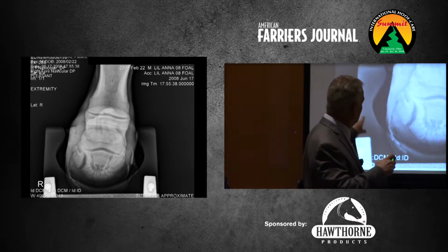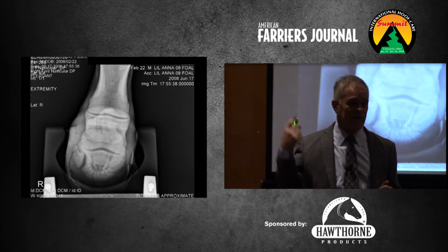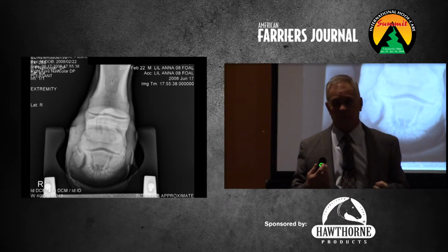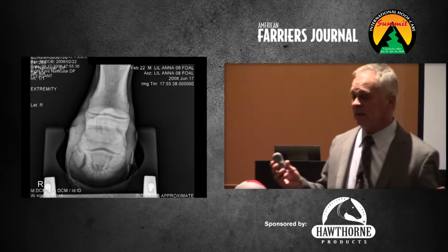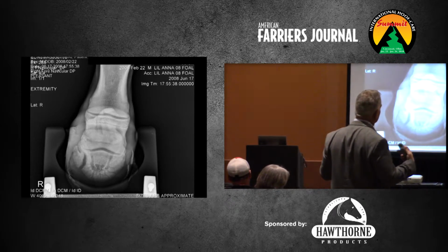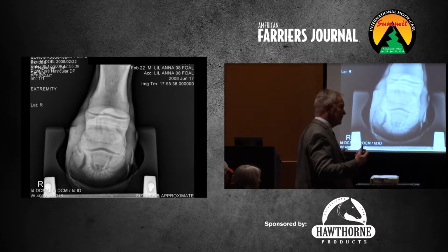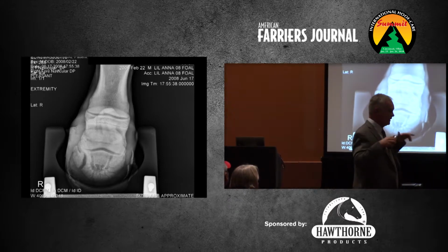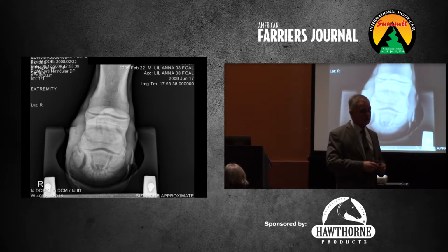And the good news is, in probably 4 months, there's not a person in here who could tell that filly ever had a fracture. It healed perfectly, and the foot came back to normal. So me being a surgeon, I'm thinking back, how many foals have I operated on that had that? Because we just looked at their foot. And then those of us who were radical started taking the lateral view and then never thought to take that view. So, don't know.